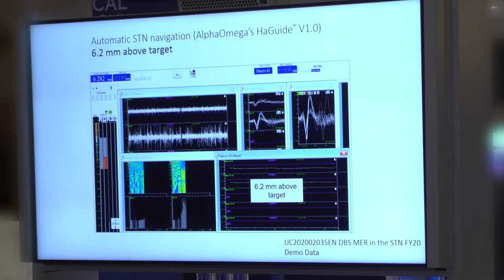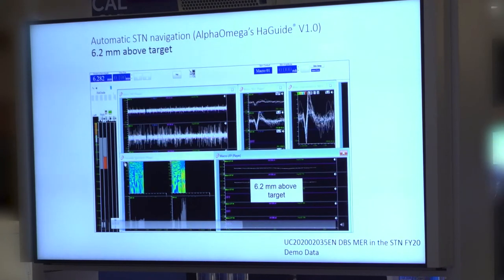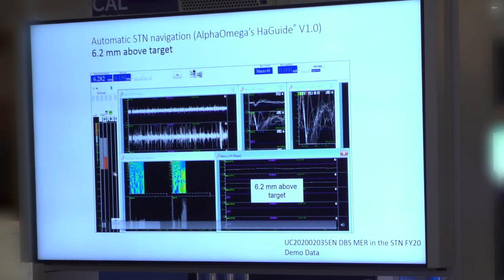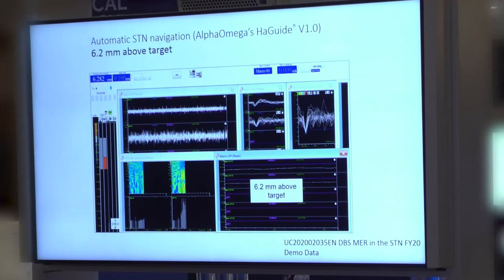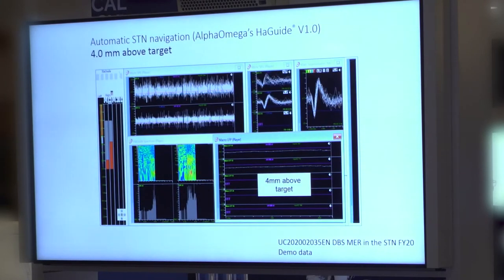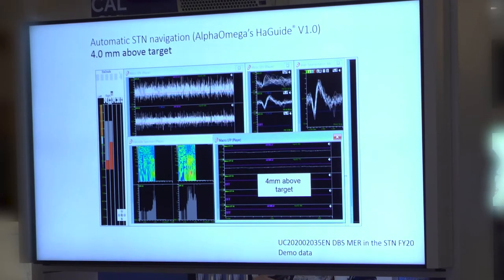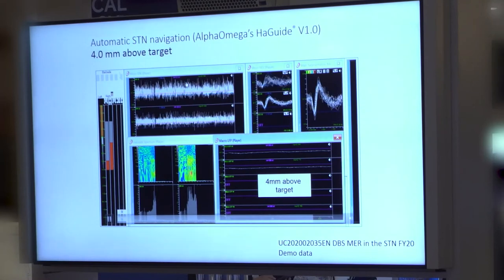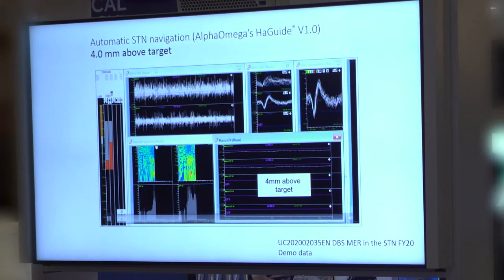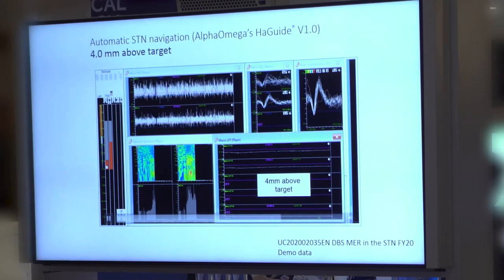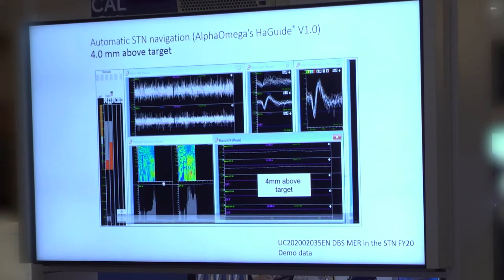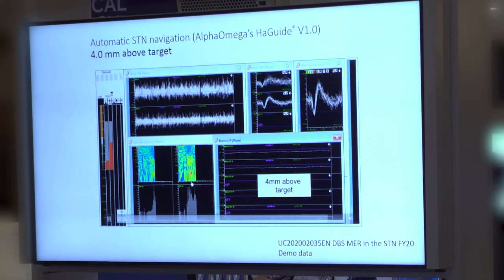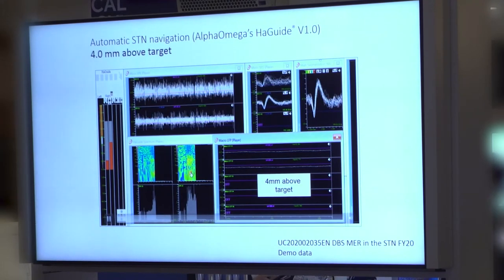One of the electrodes has gone in. Notice that the signal is red — red because it's picking up the beta activity and the theta activity of two different oscillatory frequencies in the part of the nucleus we're recording from. Going further into the nucleus, we can see that in both electrodes we are within the subthalamic nucleus. There is a very large increase in background, with random bursty-type firing, and the red shows both signals are oscillatory. You can see the increase in RMS just as we enter the nucleus, with a dominant beta frequency and a lower frequency simultaneously.